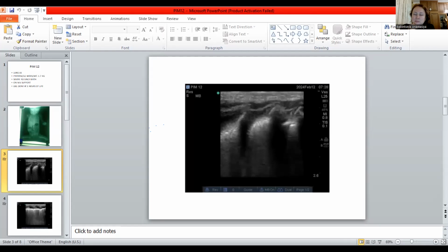The open lung strategy, as described by colleagues, usually involves keeping the lung ultrasound at the area where you find most atelectasis, and you increase the PIP or PEEP. I would usually increase the PEEP in increments of 1 to 2. If I'm at 5, I'd go up to 7, I might go up to 9. I'd rarely use a PEEP above 10 unless the baby is much older. In older babies we commonly use PEEPs up to 12, but I don't use PEEPs higher than that.